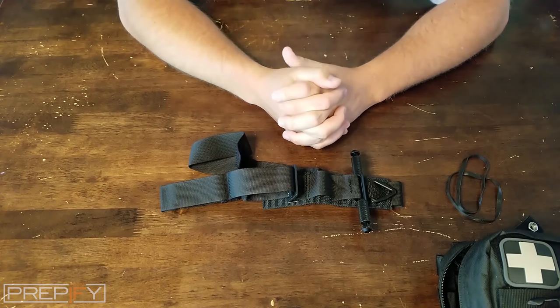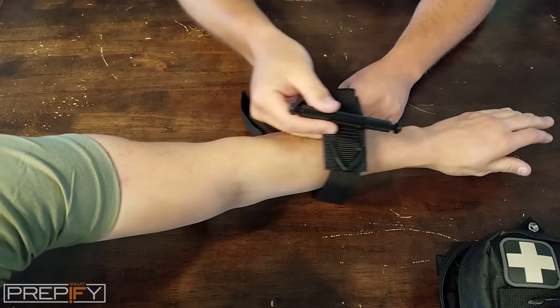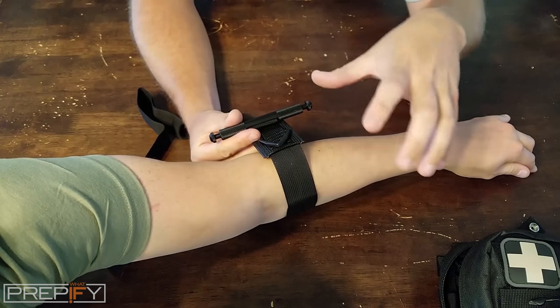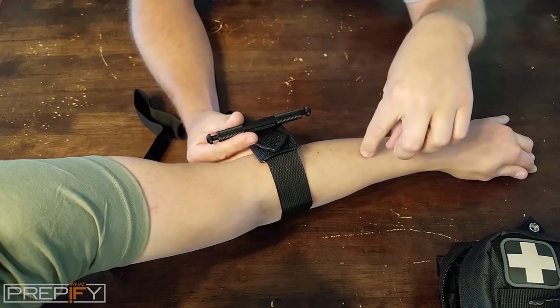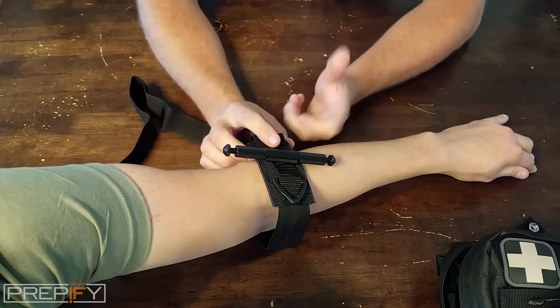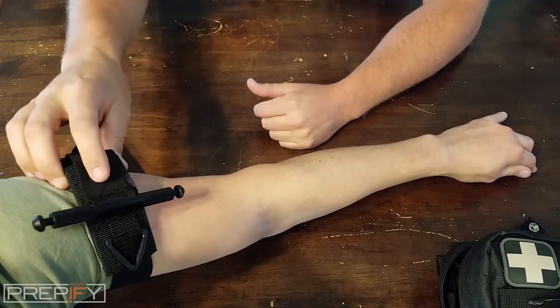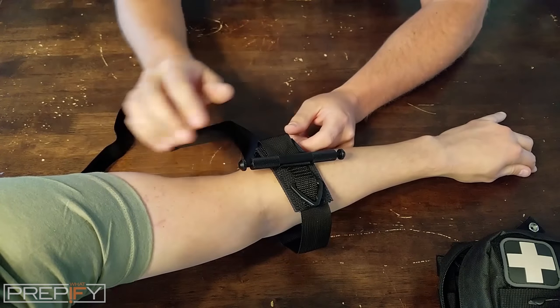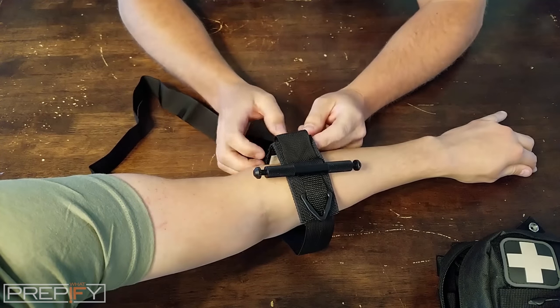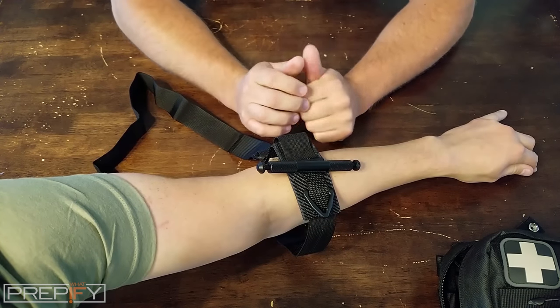Make sure it's readily available and that you've practiced so you can apply it correctly. Slide it straight on — most manufacturers say to place it between three and five inches above the wound. If you're concerned about further injury near the wound, it won't hurt to go all the way to the top of the arm or leg. Either way, you're cutting off the blood supply below and stopping the bleeding.